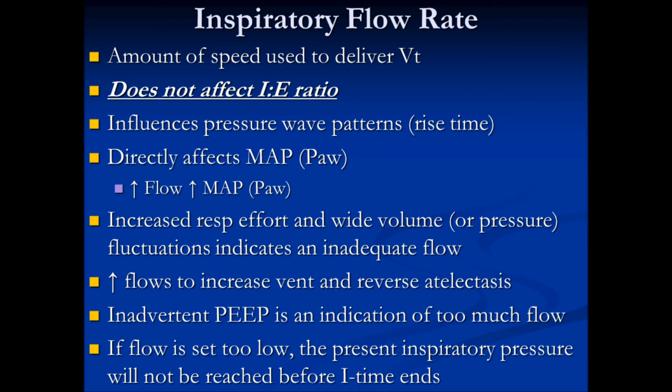And then increased respiratory effort and wide volume or pressure fluctuations indicate inadequate flow. So if you have a patient that needs more flow, you will see a change in their respiratory effort.